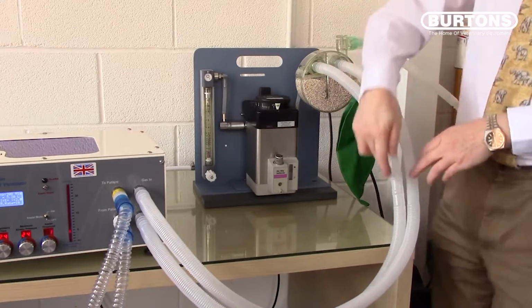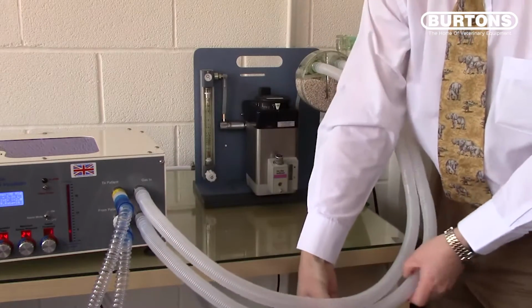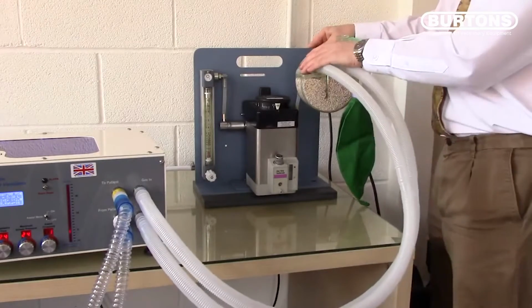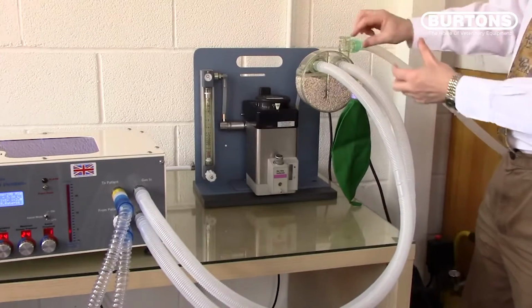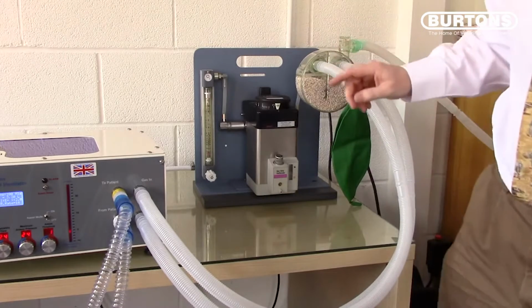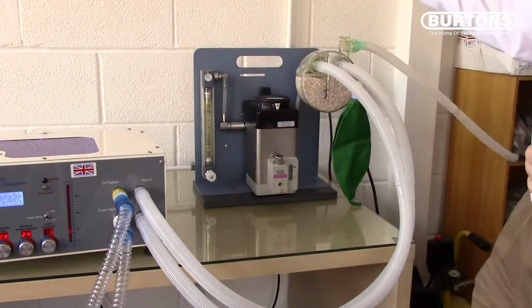Gas from the inspiratory port of the circle passes down to the gas in port of Merlin, and gas from the gas out port of Merlin passes back up to the expiratory port of the circle. And then excess gas is voided through the spill valve out into the waste gas circuit. So this is the tubing setup for a typical circle configuration.